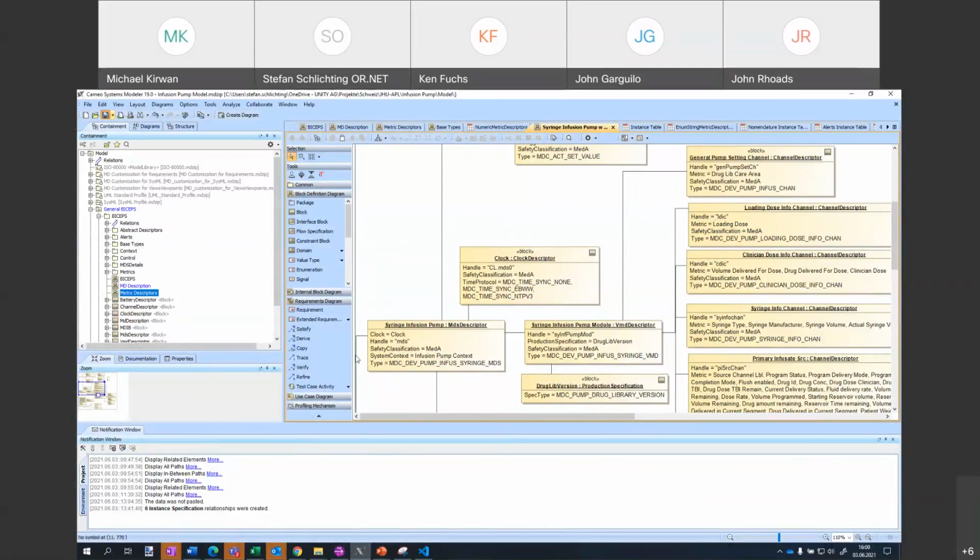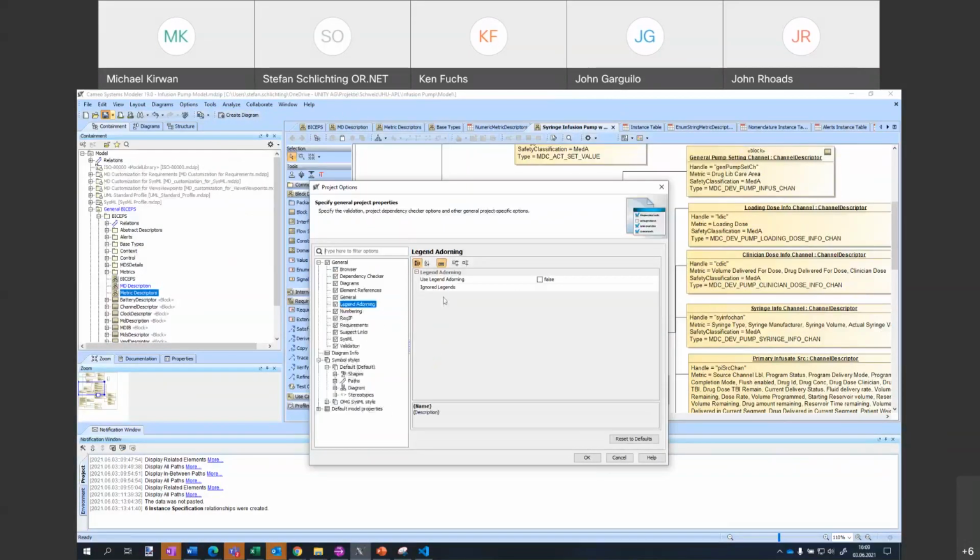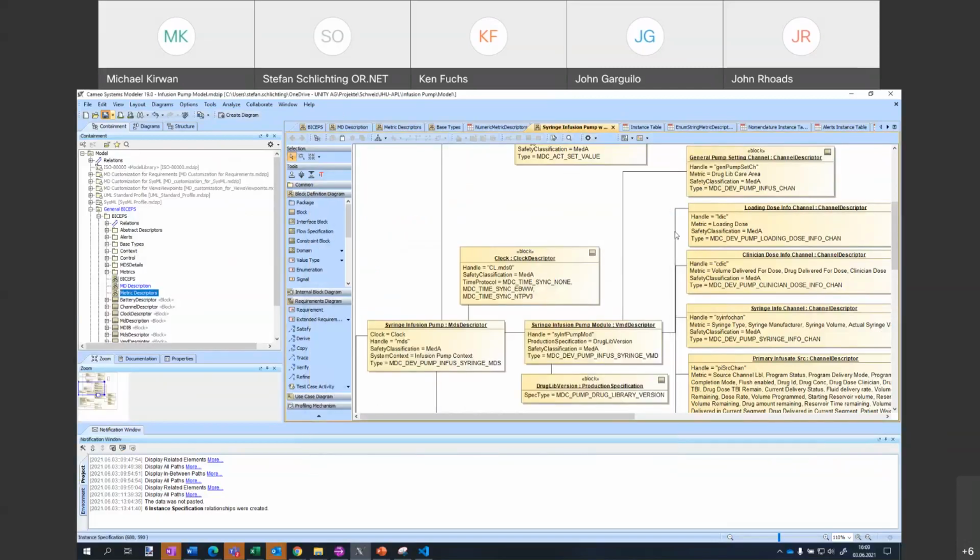So here at the beginning, let me check, I'll do you a favor and highlight it a little bit with colors, which I typically turn off due to performance. It's easier to read.